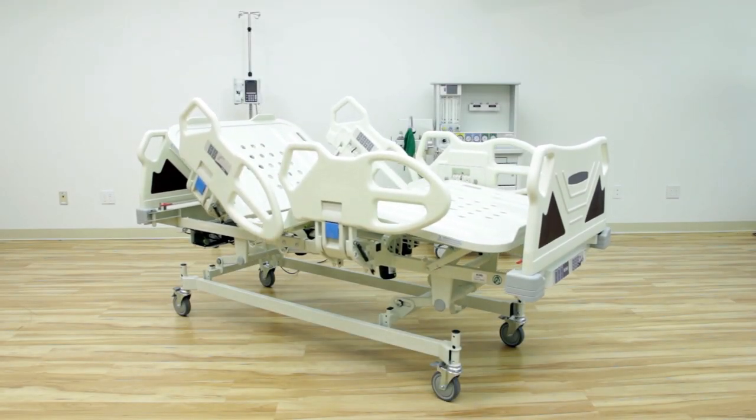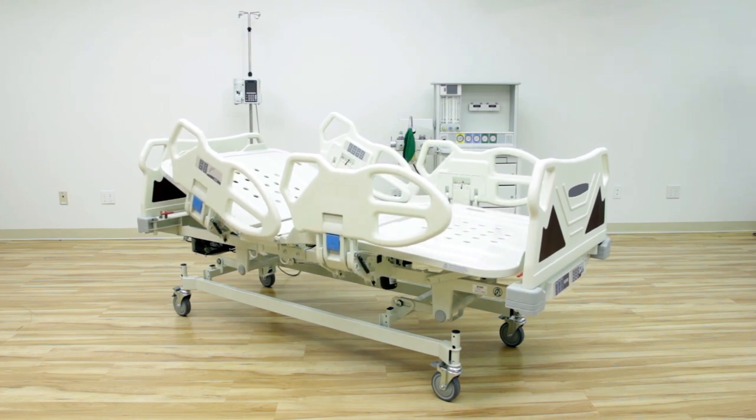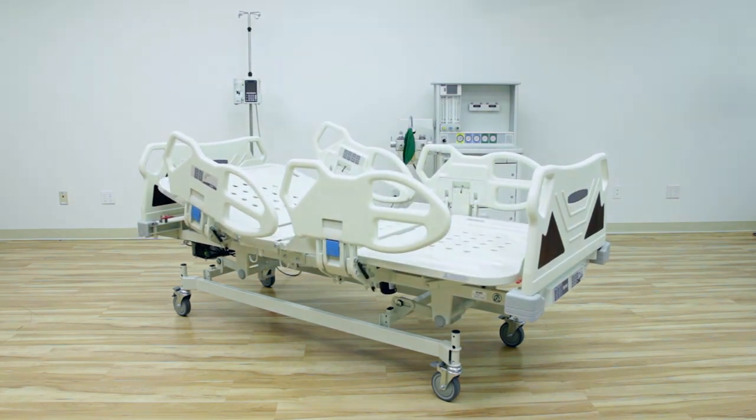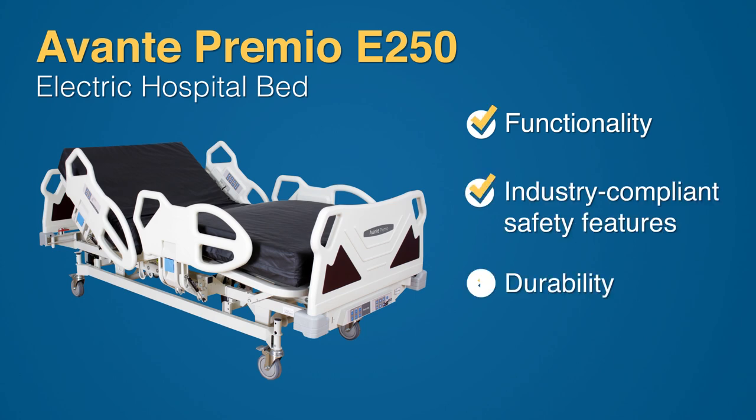The Premio E250 electric hospital bed is the perfect solution for hospitals, surgery centers, and teaching facilities. The Premio offers functionality, compliance with industry safety standards, and durability.